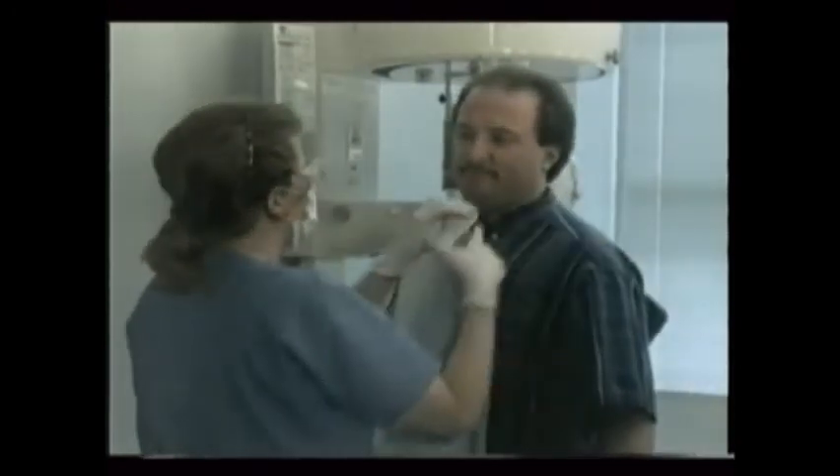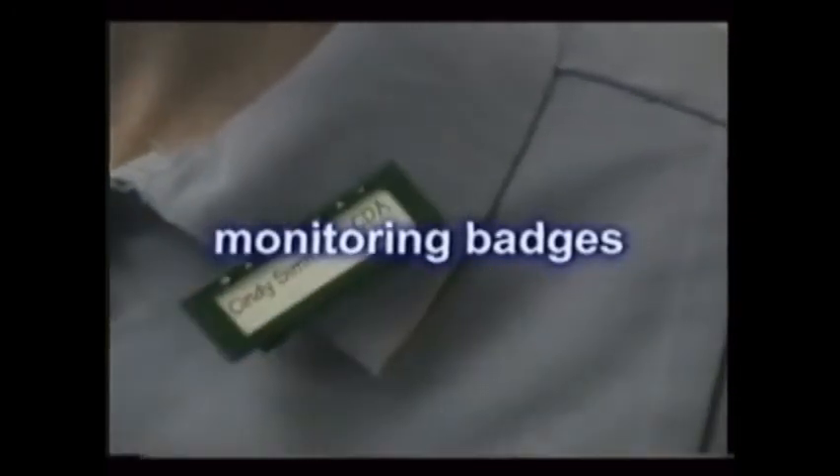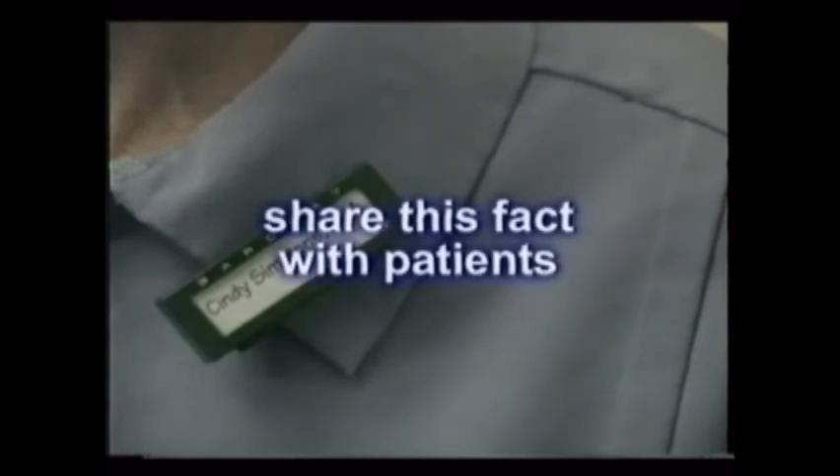Remove your gloves and other personal protective equipment and take the film cassette to the dark room for developing, and then return to the machine and prepare it for the next patient. Finally, throughout the process of dental x-ray, you may wonder if there's a need for wearing personal radiation monitoring badges. The answer is a simple no. Historically, radiation levels are so low in dentistry that badges have never been required, and this is another testimonial to the degree of dental x-ray safety that you can share with your patients. It's why it's never been law.